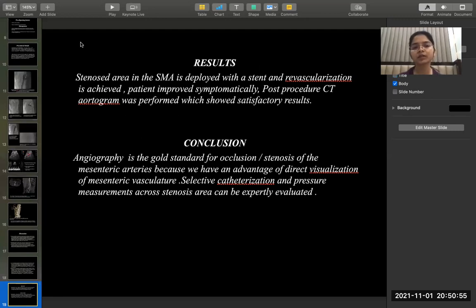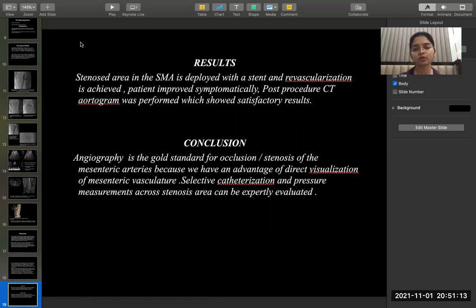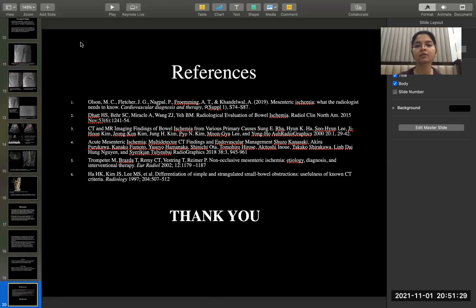In this case, the stenosed area in the SMA was deployed with a stent and revascularization was achieved. The patient improved symptomatically and post-procedure CT aortogram showed satisfactory results. In conclusion, angiography is the gold standard for occlusion or stenosis of the mesenteric arteries, offering direct visualization of the mesenteric vasculature, and selective catheterization with pressure measurements across stenosis areas can also be expertly evaluated. Thank you very much.